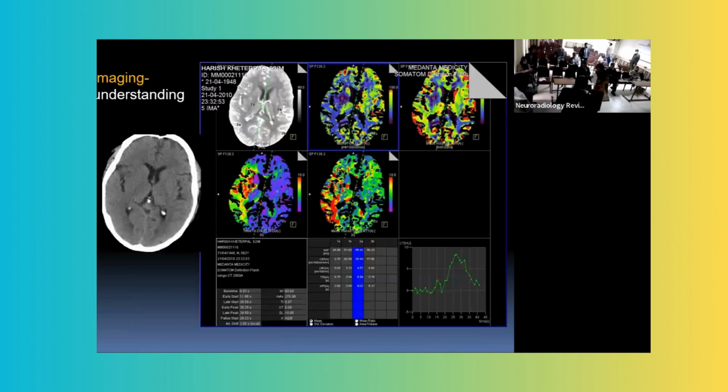Neuroradiological imaging understanding is very critical for any intervention. Either we are dealing with CT perfusion or with mechanical thrombectomy, because diffusion-perfusion mismatch is critical if you are doing mechanical thrombectomy. This means that if the patient has landed within 6 hours, we do an MRI, and there is hyperintense signal on DWI but normal signal on FLAIR images. So this is viable brain and we can save it.